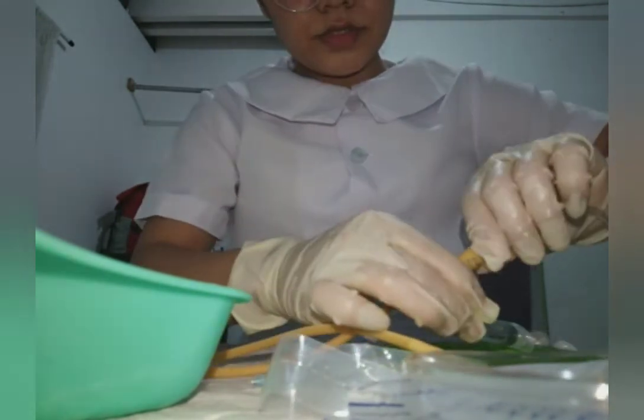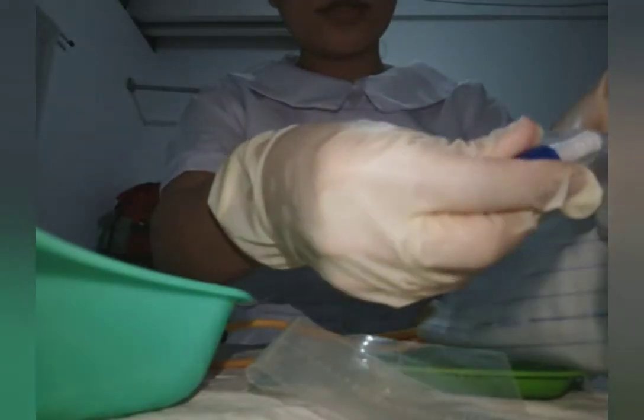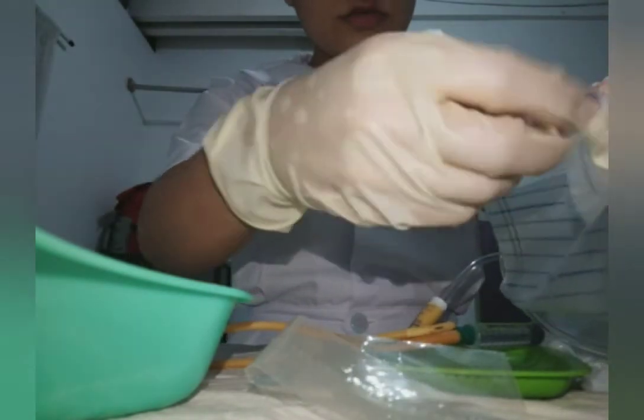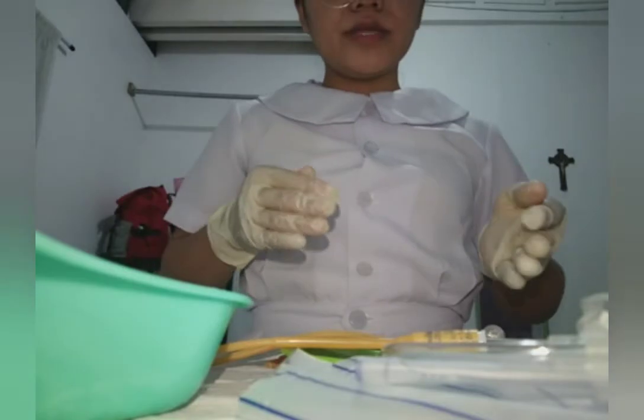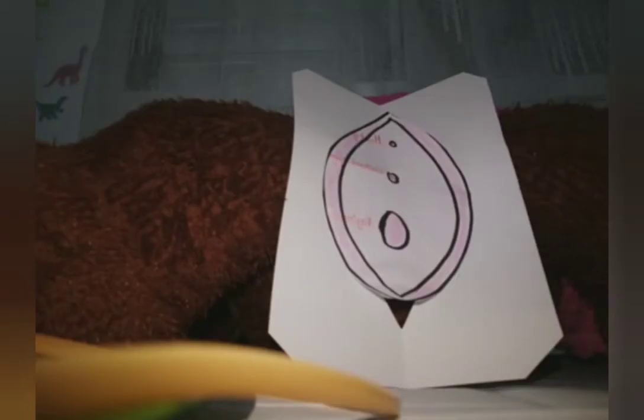Ensure that the drainage valve emptying the port is clamped. This one is secured and clamped. It's not open, it's closed, so that there will not be any discharge on the floor. I will bring this kit to the sterile field in between the patient's legs. Already brought my kits in between the patient's legs.